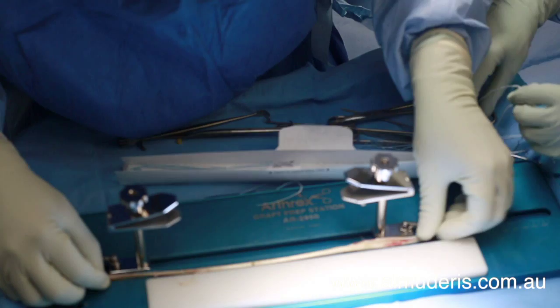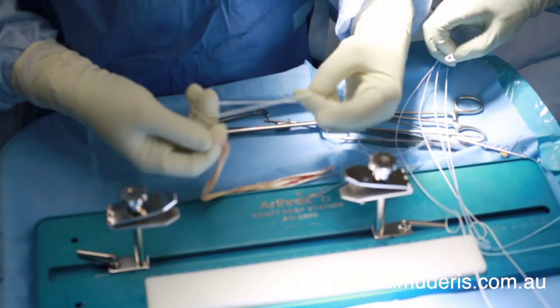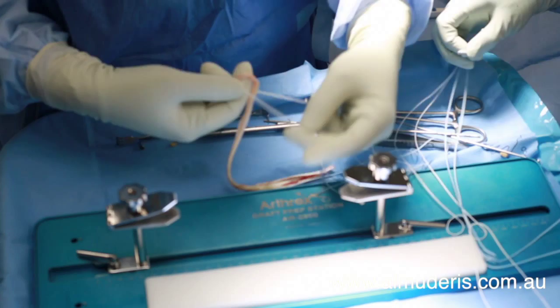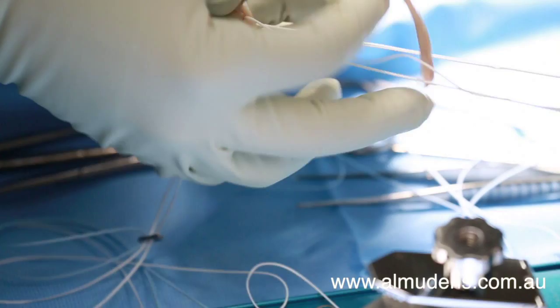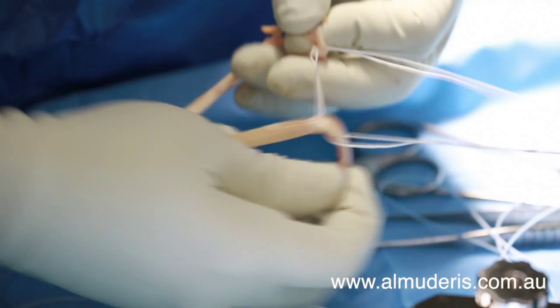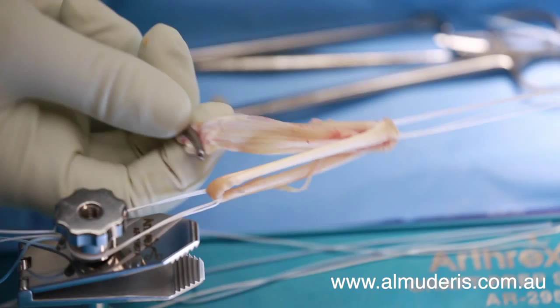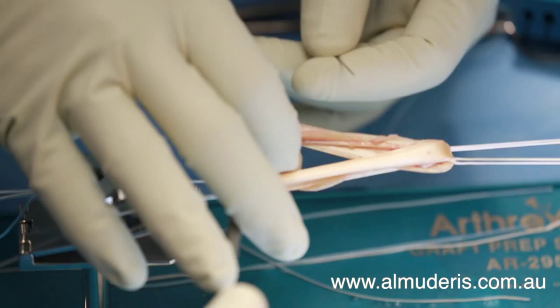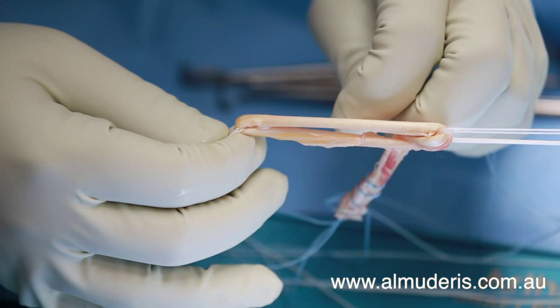The tendon is taken over to a graft preparation station where it is measured and attached to fixation devices which will be used later in the operation. The surgeon threads a single strand tendon between two Arthrex tightrope devices. This selection and construct type minimizes trauma to the patient and maximizes the use of the single tendon harvest.